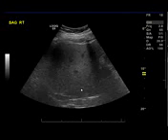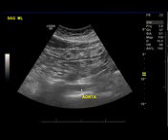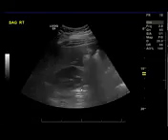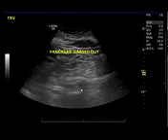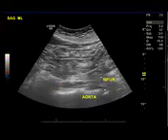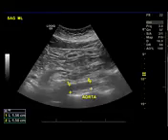And the reason this has become important is because we all want to recognize an abdominal aortic aneurysm before the patient has a catastrophic event and comes in with a ruptured aortic aneurysm. So there is a Welcome to Medicare program. When males turn 65, they get a free abdominal aortic ultrasound looking for aneurysms, because aneurysms are not usually symptomatic. And then these would be the areas of the bifurcation into the common iliac. So just remember, I showed you the cava on the other case. This is the abdominal aorta in a limited fashion.